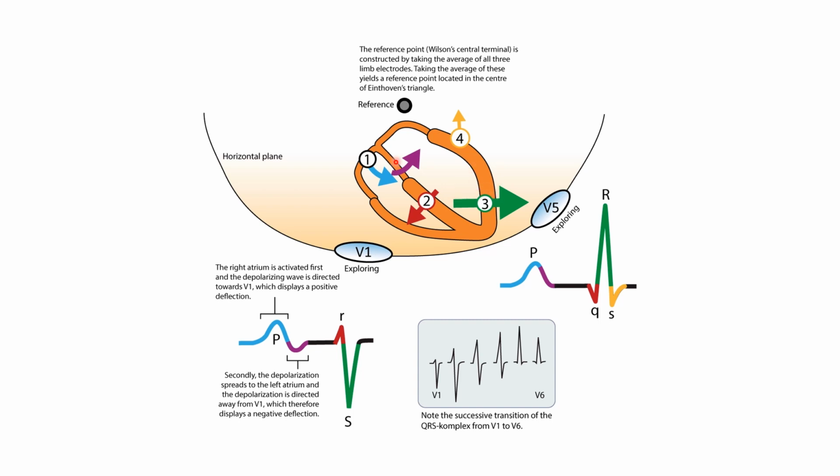Normally the left ventricle should be the big one, and the right one should be the smaller one because of the pressures in the systems. But with a high pressure over time, which leads to hypertrophy, or an acute highly strained situation in the right ventricle, you might see patterns according to that.